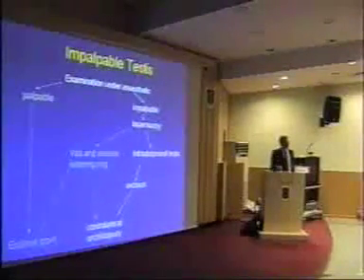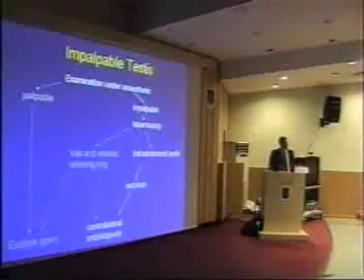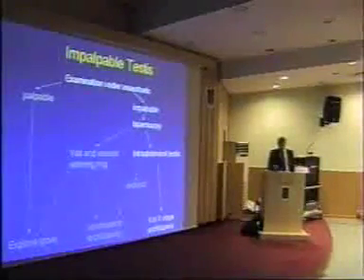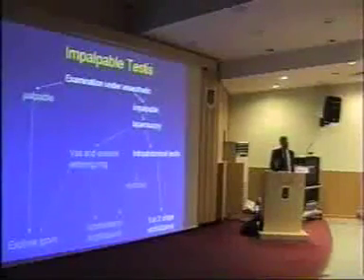But because you've got a solitary testicle remaining, you do a contralateral orchidopexy on your solitary testicle so that the chance of torsion is minimized in that solitary testis. If, however, you find the testis, you do a 1 or 2 stage Fowler-Stevens orchidopexy. And I showed you the difference.